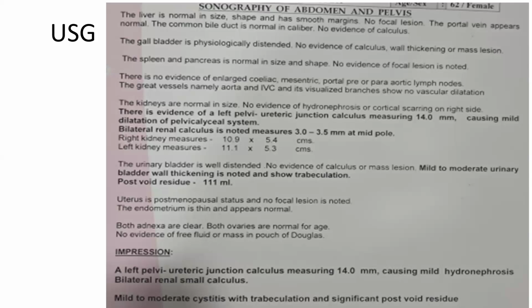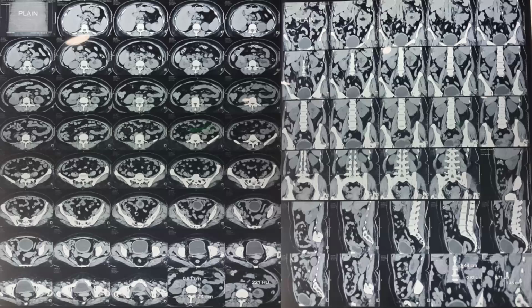Whenever you answer the exam, please mention which area you want to cover. Don't just say one blank statement about contrast enhanced CT scan. You should always say, I want to cover the KUB or abdomen, pelvis, thorax. CT of the abdomen and pelvis, sir. There is one more suggestion: when you are asking for a contrast for a malignancy, always ask for a triple phase CT, the tumor protocol.